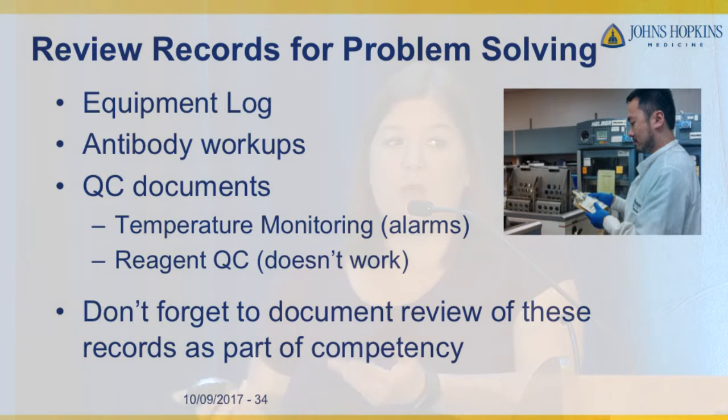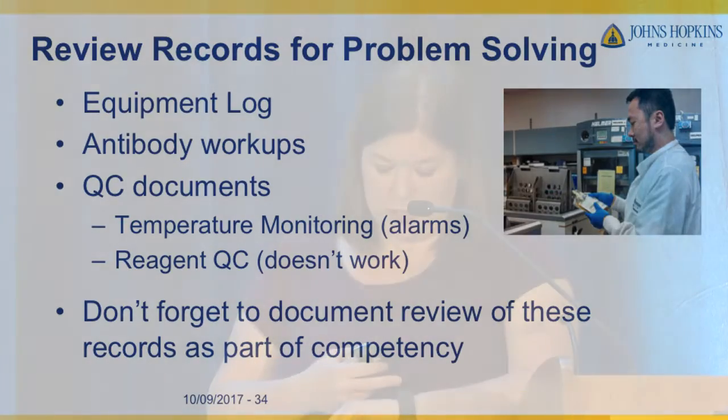Another thing you can do is if you have a document of it, photocopy it, attach it to the competency, or scan it and attach it to the competency so you don't have to go hunting for it. It makes it a little bit easier, but if you have a good system of logging things, like you keep your equipment logs electronically where you can pull it up pretty easily, then there's no reason to add it to it, just as long as you know what you're looking for and have some way to find it. All right, so that's pretty much what we do.